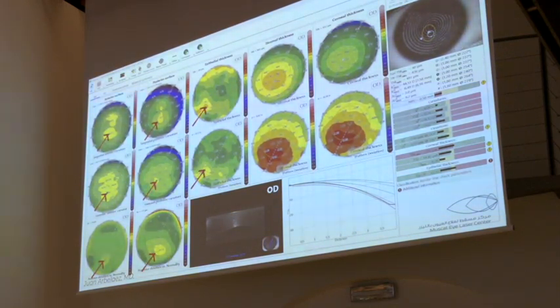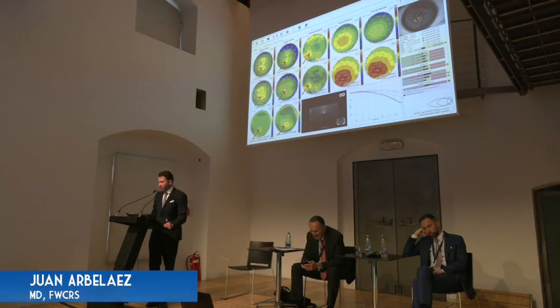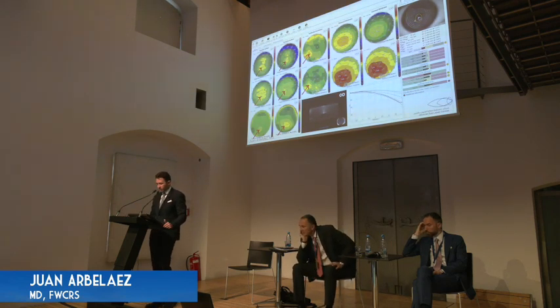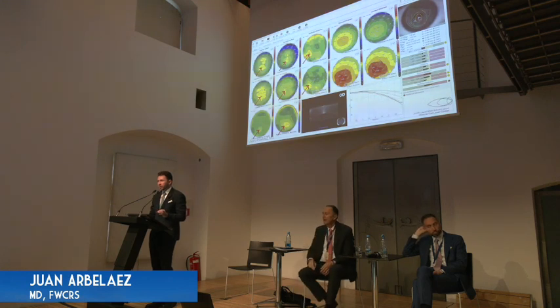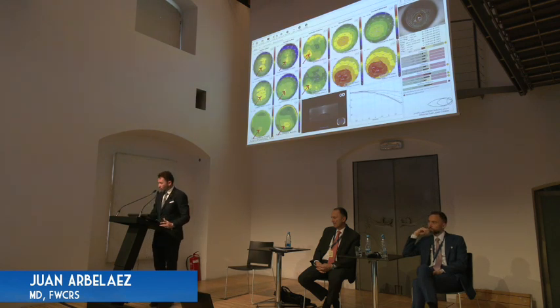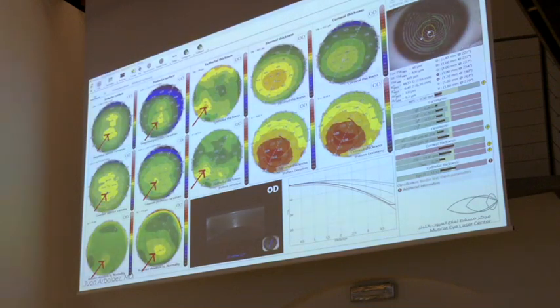So this is how the screening layout of keratoconus looks. On the left we have all the anterior maps. Afterwards, we have the posterior, and then the epithelium, stromal and corneal thickness maps. We see that all the points are coincident, showing a very close relation to each other, and they create a white circle that looks quite small and falls where the majority of the cases with keratoconus should be expected. And the machine is clearly identifying that this is a borderline case.